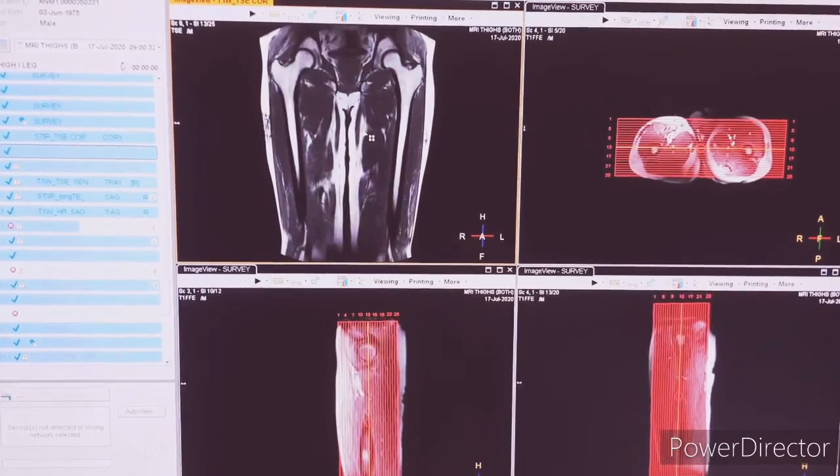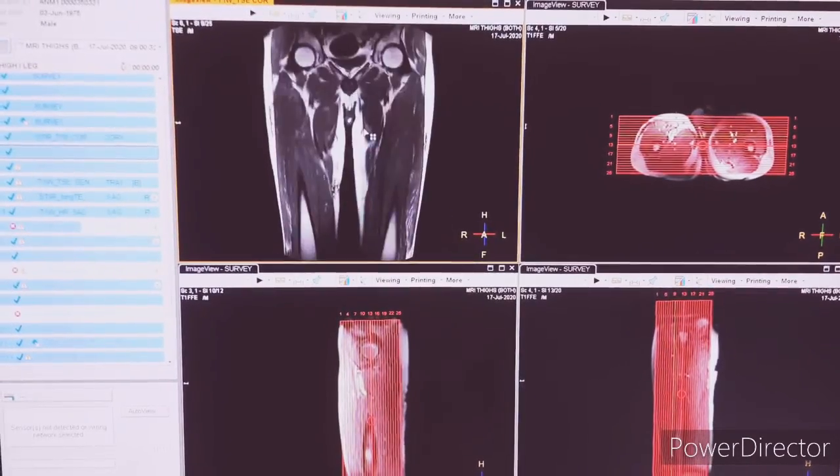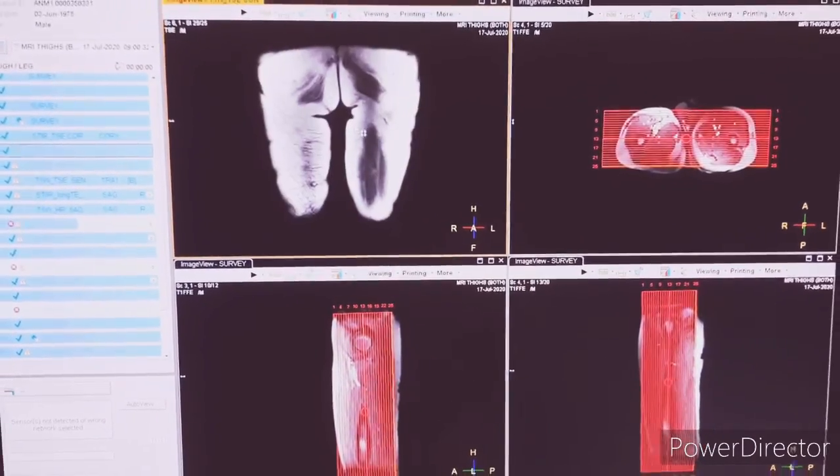Next is T1COR. The planning for T1COR is the same as STIRCOR. You can see here.